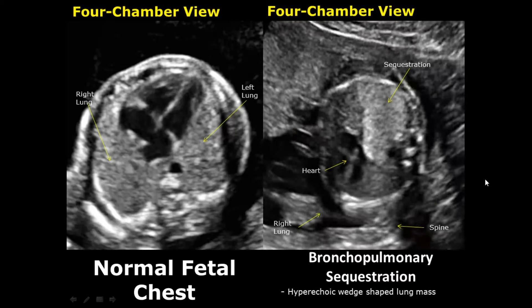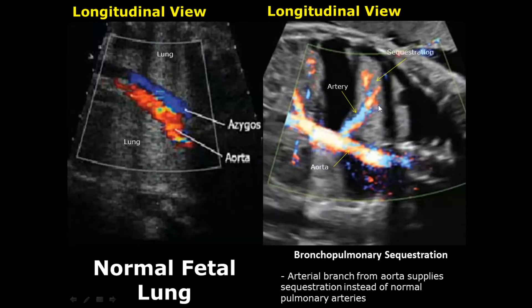A bronchopulmonary sequestration is defined as abnormal lung tissue that is disconnected from the tracheobronchial tree and is non-functioning. It usually appears as a wedge-shaped hyperechoic lung mass. On color Doppler, we will see a branch from the aorta supplying the sequestration — it does not receive blood supply from the pulmonary vessels.